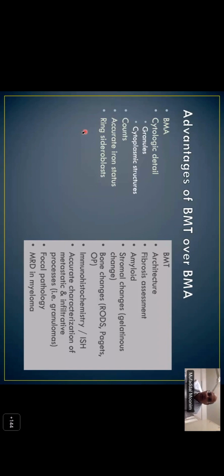Okay. On the other hand, the trephine gives you architecture. Okay, something that you can't see on the aspirate because we are dispersing cells in the aspirate. You can identify fibrosis and assess it.